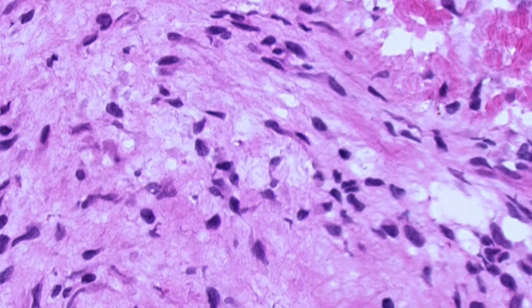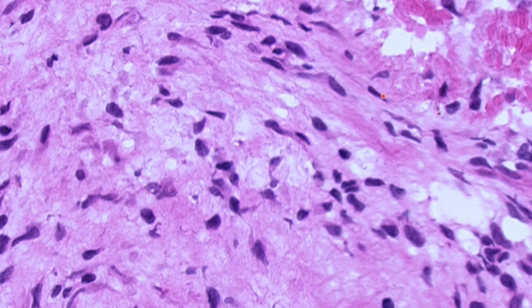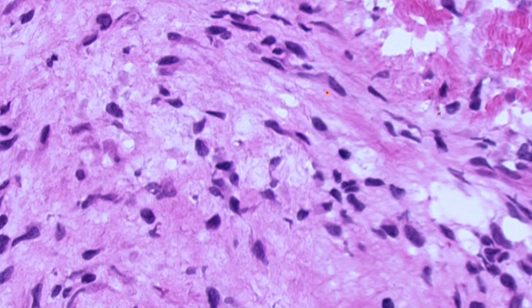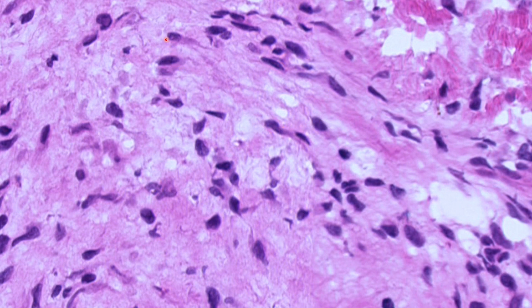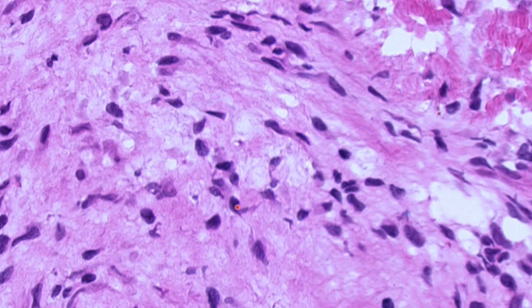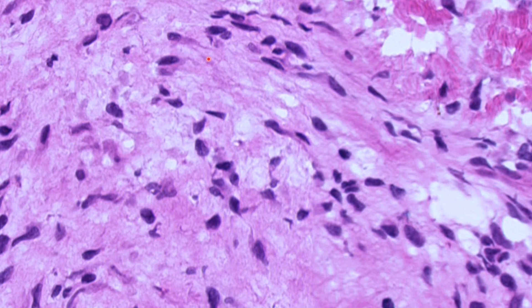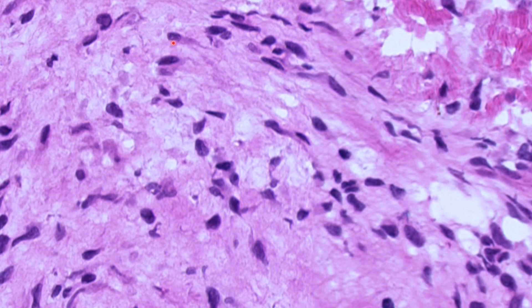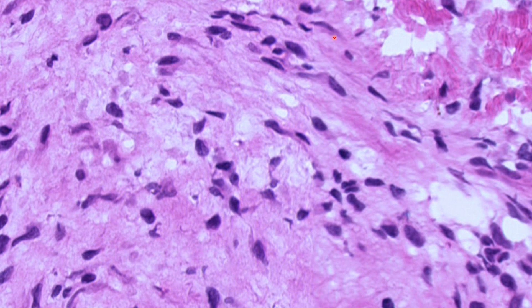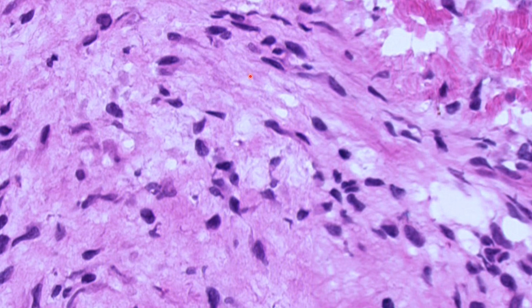Moving to the next slide — keep the mental image of the fibroblast. Now looking at these nuclei here, comparing them to the fibroblast's thin nuclei: are these a bit bulky? Can I call them plump nuclei? Yes, definitely. The majority of nuclei here are plump. When the nuclei is plump and blue, if you look at each nuclei it has a comet-tail-like blue projection downwards — a plump nuclei with a bluish projecting tail.